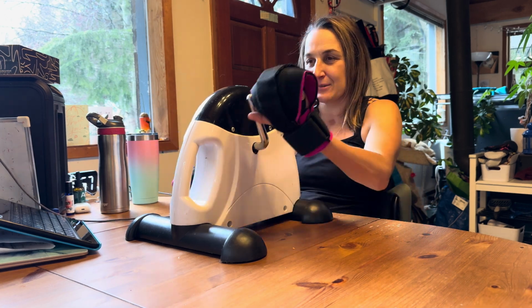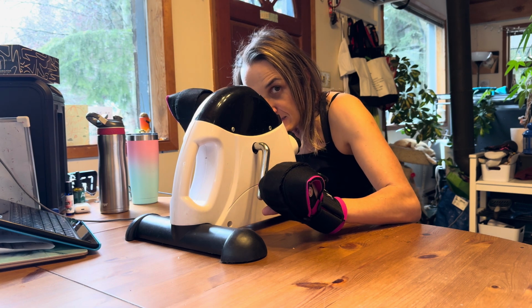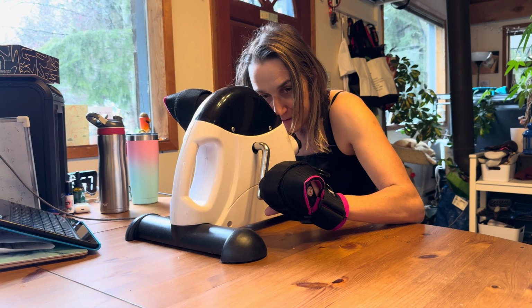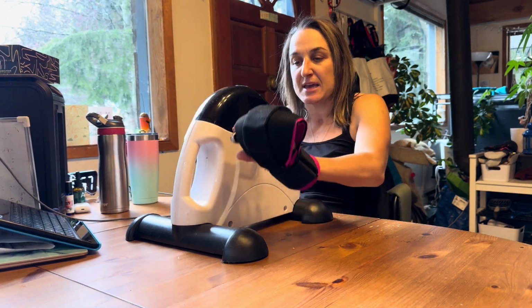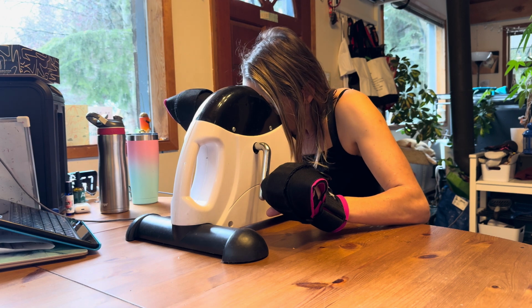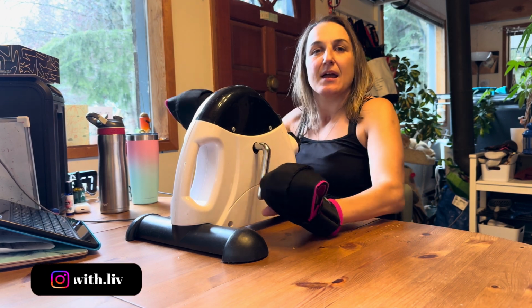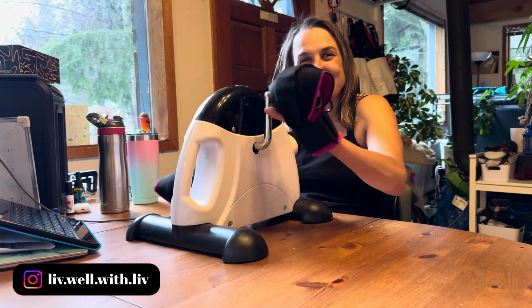And then if I need to increase the resistance, I can just increase it with my chin. Stand up in the front there and make it easier with my chin as well. Make it easier or harder if I'm already strapped on the bike. And there you go. Now I'm ready to go for a spin and target the Tour de France.